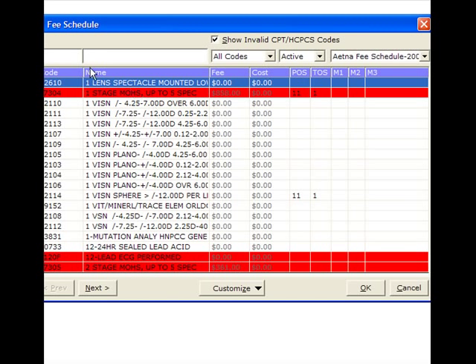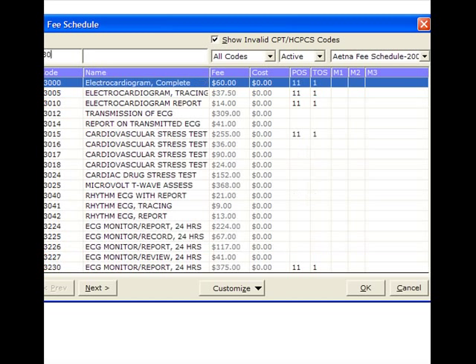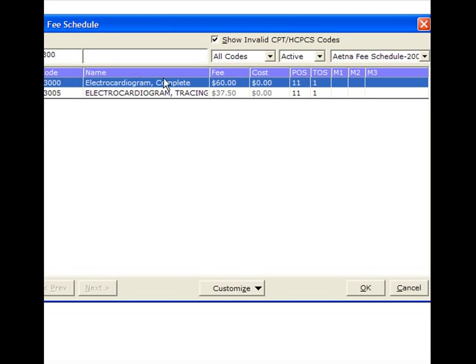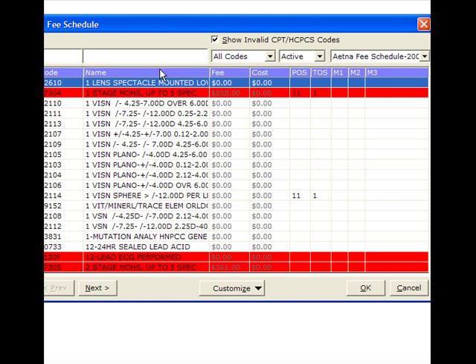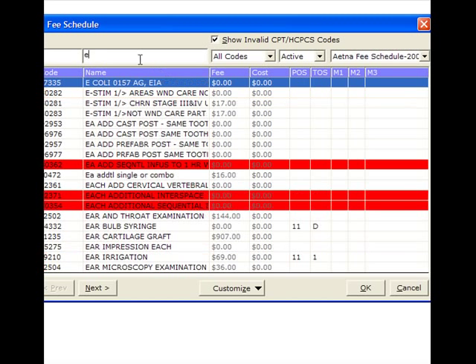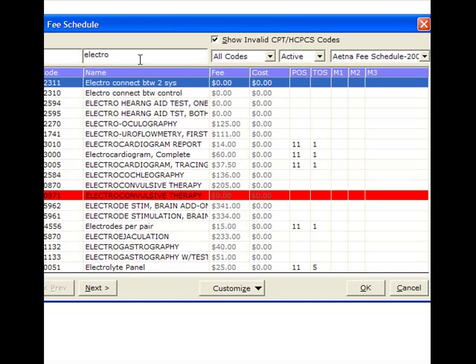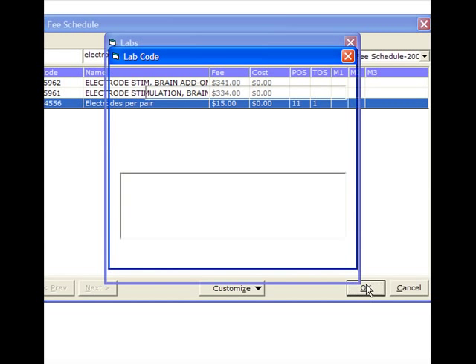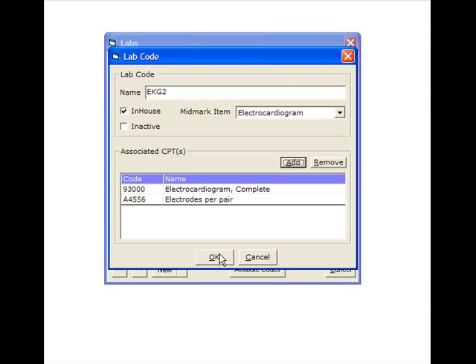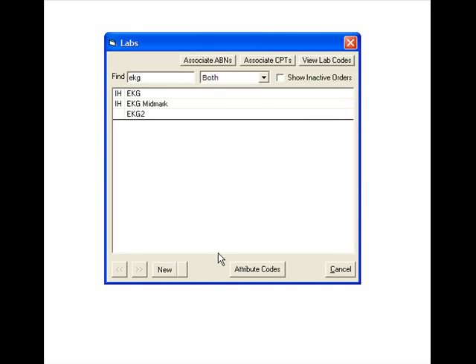We'll now add the CPT codes to automatically bill for your EKG, that's 93000 and we'll add the electrodes. We do bill for the electrodes and we get paid for it by the insurance companies. So we'll click OK. We'll now bill those items for us automatically.